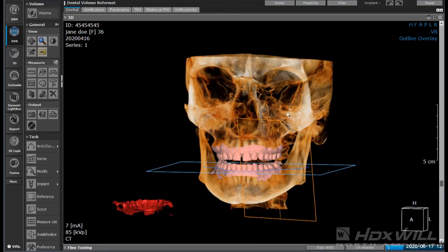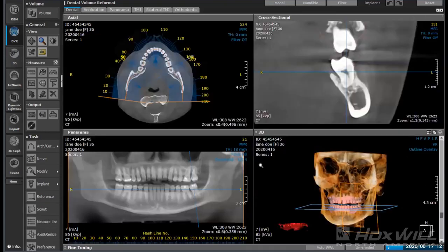And as we go through there, I realize that this may be going relatively fast for this lecture. I expect that if there are any questions, obviously we have the video, you can go back and review that a little bit, but we also have our education team. Feel free to reach out to our education team at any point. They're more than happy to get on and walk you through each one of these steps, and show you how these things come into play.